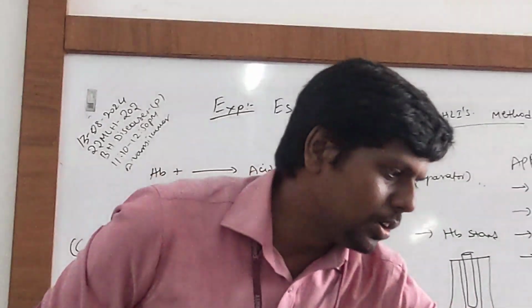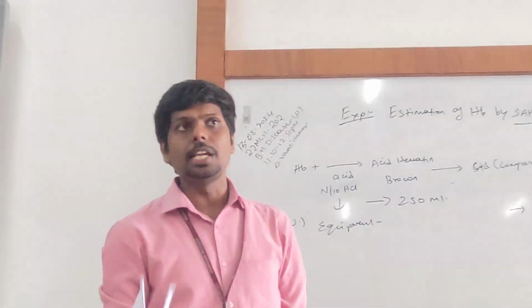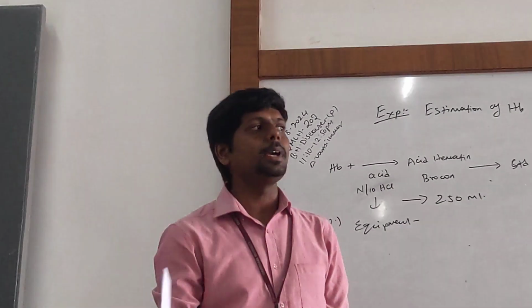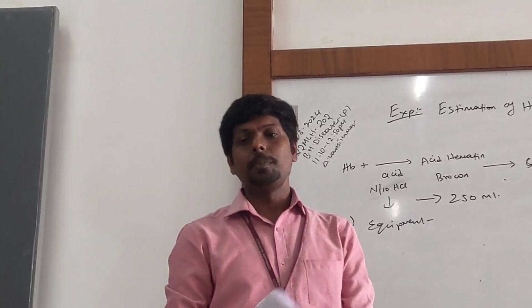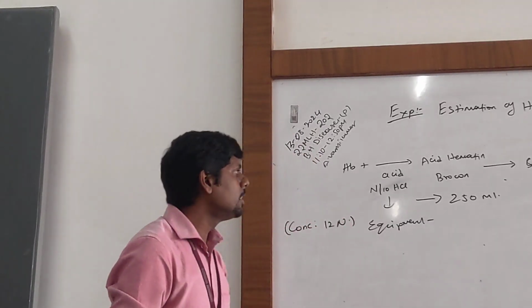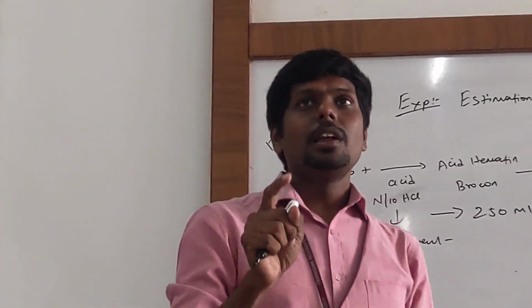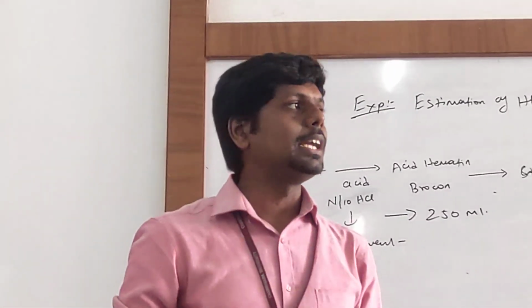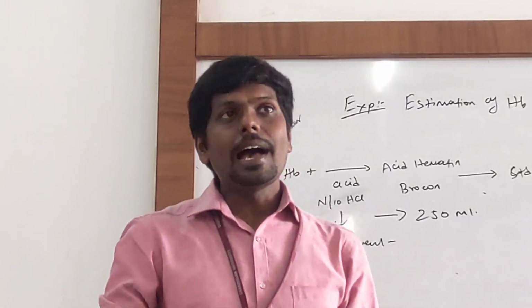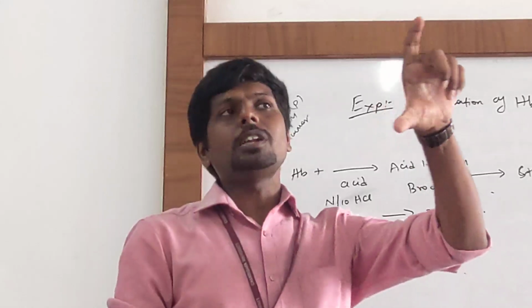Then we have taken distilled water, and we have concentrated HCl. Concentrated HCl must be held with gloves, not directly. It's very powerful. And there is a thumb rule: never add water to an acid, but you should add acid to the water. Water should always be the large quantity.